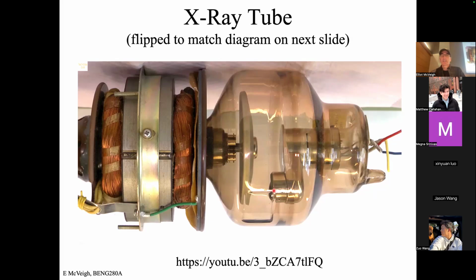Oh, the reason it spins, that's a great question. If we left it stationary and we turned this on and we had electrons flying across here hitting the target, it would melt. So you want a lot of X-rays coming out. To get a lot of X-rays, we need a lot of electrons to hit it, and it gets really hot. So basically you increase the effective area that you're irradiating, so the energy that's deposited in the target goes down, right?